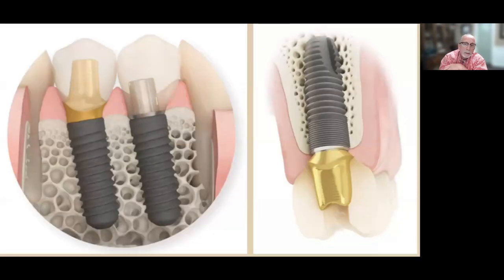Where I might use that thing because it's a third of the cost and make a bicuspid crown over it. And I look at it like this and I think, wow, that was just not super smart because the emergence profile is not where it should be, right? The support of the crown is certainly not where it needs to be. All that space above the occlusal surface of the abutment is scary. The hole certainly isn't in an ideal position, but implants are not going to be placed ideally every time.